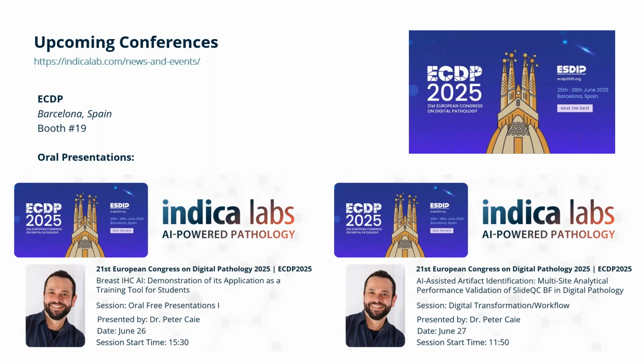Gotcha. Okay. Well, thanks for that guidance and info, Ghislaine. Let's see, the next question here, we're getting a lot, so thanks, folks. I have plenty of time to answer these, so keep them coming.